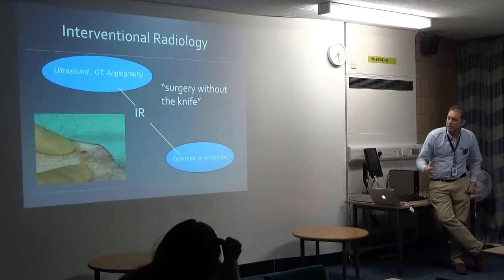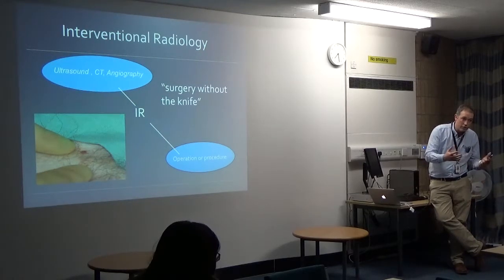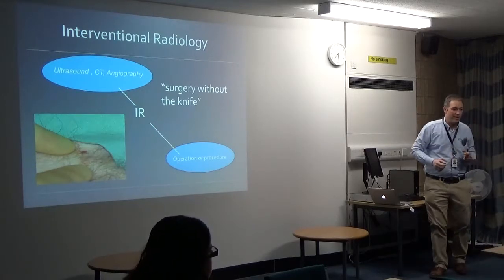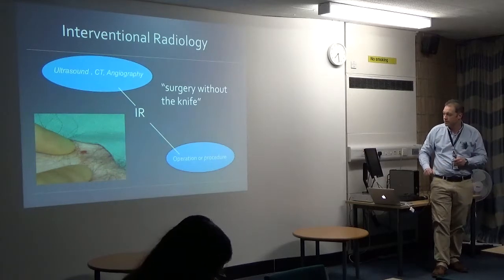So interventional radiology is really surgery, but without a knife. You've heard of keyhole surgery, we do pinhole surgery and make a tiny little nick in, say, the groin, give lots of local anaesthetic, and we just put a needle into the artery in the groin, and from there we can access anywhere in the body to deliver treatments. We often use ultrasound to guide our needle to start the treatments, and then we use live x-rays. So I'm glowing like the Ready Brek man when I get home, because we're using live x-rays to guide catheters and wires around the body to do these treatments.